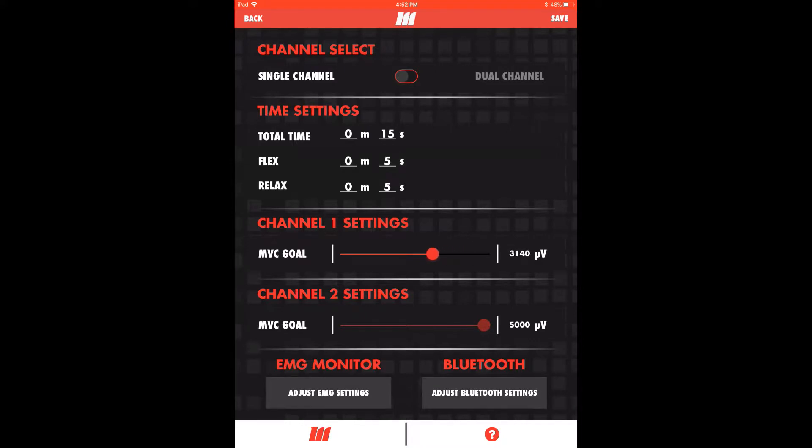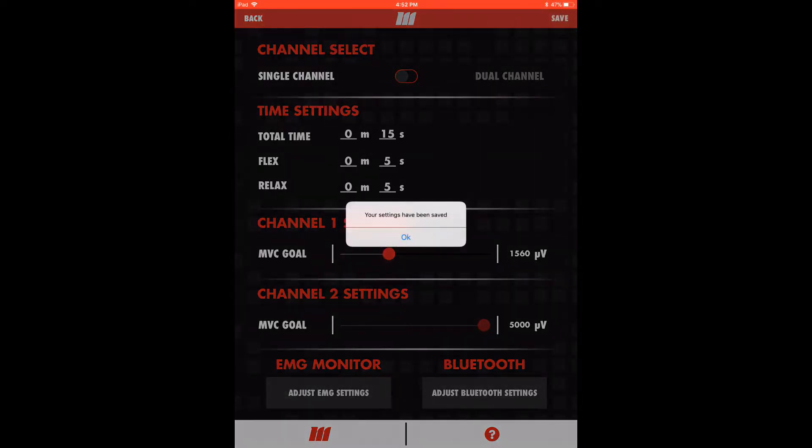Now we'll adjust our microvolt output by sliding the handle for the channel 1 max voluntary contraction goal. For demonstration purposes, we'll set our goal around 1500 microvolts. This can be adjusted later in the train module if needed. We'll now save our settings and go back to the home screen, either by tapping the back button or the mTrigger logo.